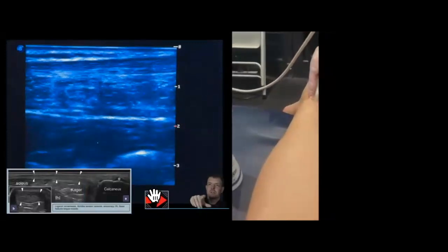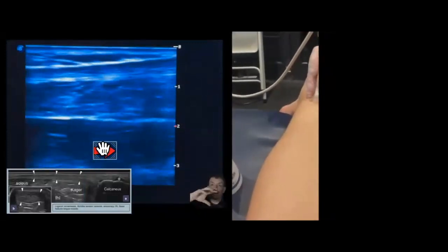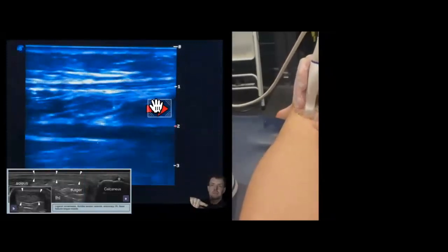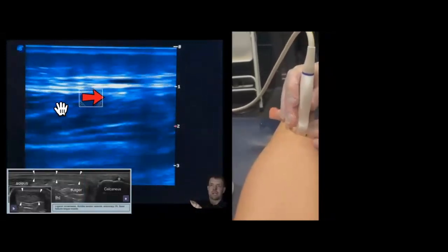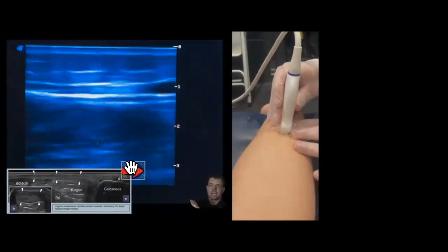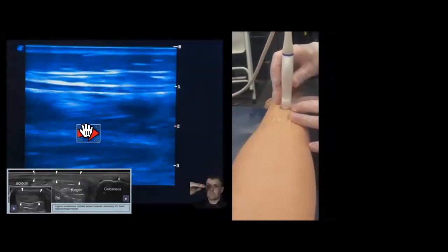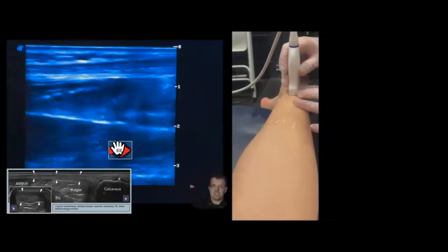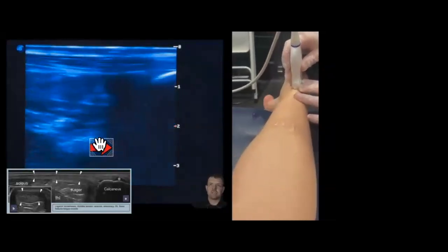And there's flexor hallucis longus. Okay, so now I can differentiate between the muscle structures. So there's FHL. So that must be soleus above it. And then there's the Achilles just on the top. And now it's turning into gastroc. And then there's FHL still. And now that's disappearing. So I can gauge the different structures and differentiate between them by getting certain bits of the anatomy to move. And especially in this area, it's quite easy.